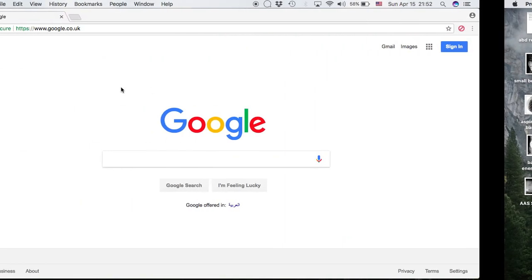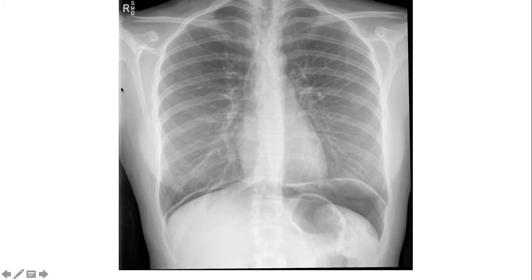So, in summary, in acute abdominal series, we have a minimum of 2 images. That's the supine AP abdomen. Next, we have the upright or standing or erect PA abdomen. PA is done for radiation protection purposes and a technical consideration also, because a PA means the patient's belly or the patient's abdomen is the part closer to the machine or the bucky or the cassette.